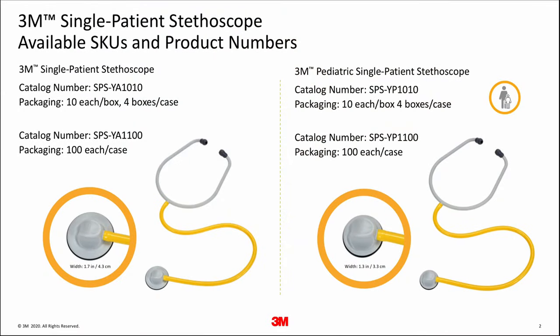The 3M Single Patient Stethoscope is available in two sizes, adult and pediatric. The adult chest piece is 1.7 inches in diameter, while the pediatric is 1.3 inches in diameter. The tubing, headset, and ear tips are all the same in both the pediatric and adult models. The only difference is the size of the chest pieces.